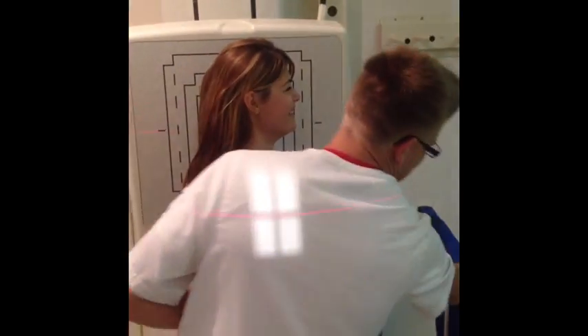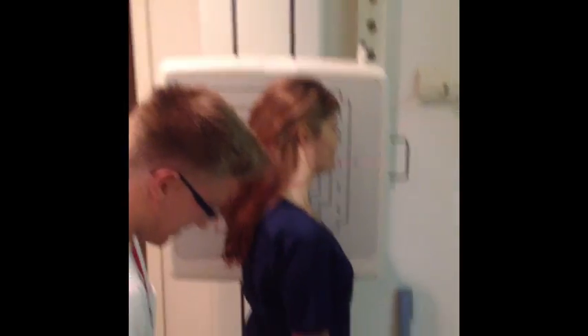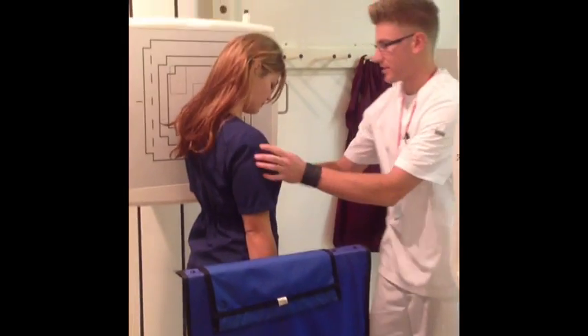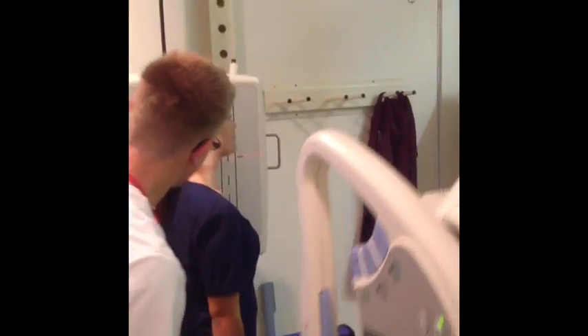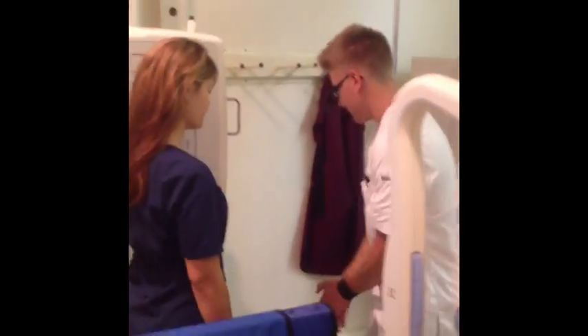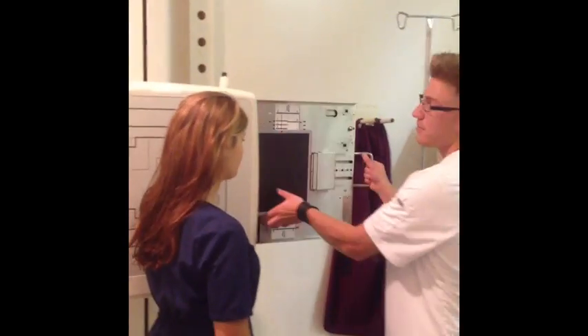I'm going to move my shield in here. Can you hold these sandpacks for me? It's just going to drop your shoulders down. I'm going to center the mid-coronal plane and grab my film out — and we'll do the lateral C-spine.